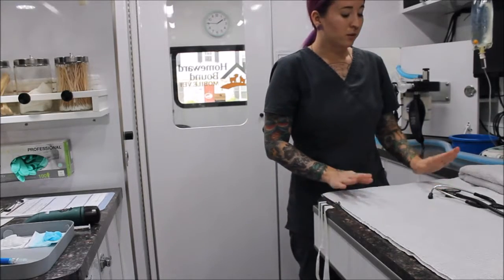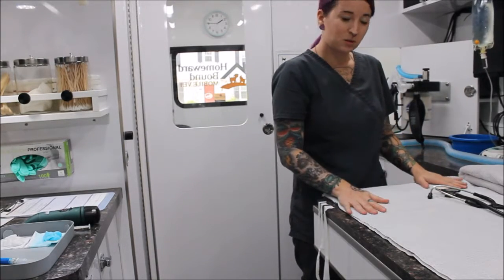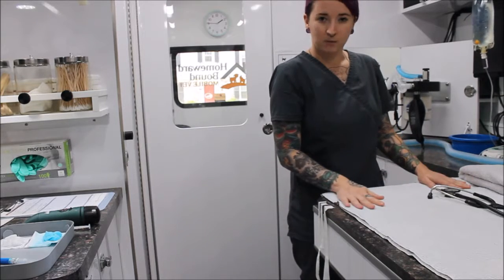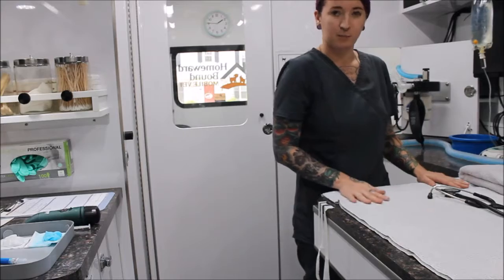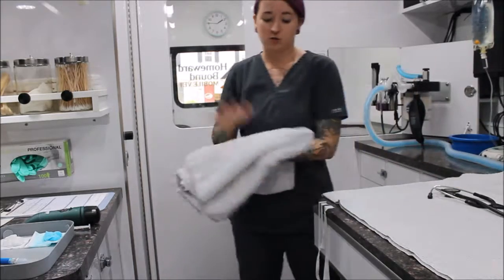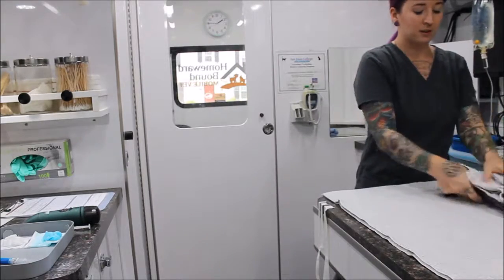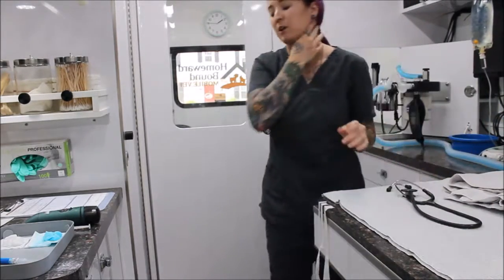So the next thing I will check to make sure I have are towels. The cold table surface can be a little uncomfortable for them, so I like to put a towel down for them to lay on. And then I also have an extra towel to cover them with, just in case they do get a little cold during the anesthetic procedure as well, because the temperature can drop.